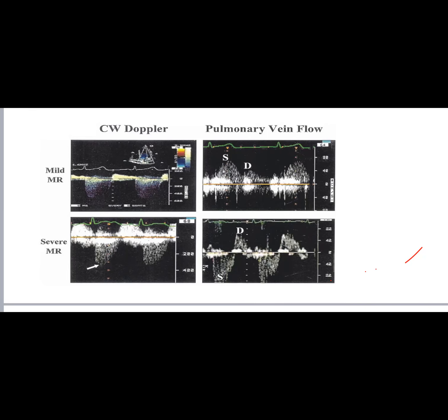In transthoracic echo, you just have one chance, only the right upper. That's the one you can interrogate. And you can have a crisp signal for analysis in only 70% of the cases. So in 30%, you cannot have a good analyzable signal. But in TEE, things are different. I can see the four and interrogate the four.